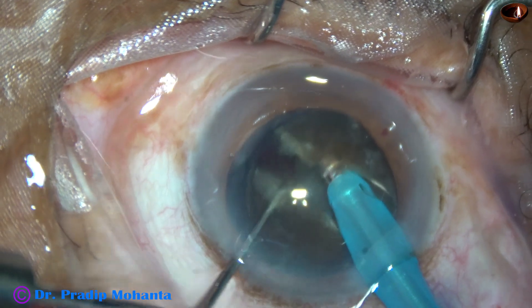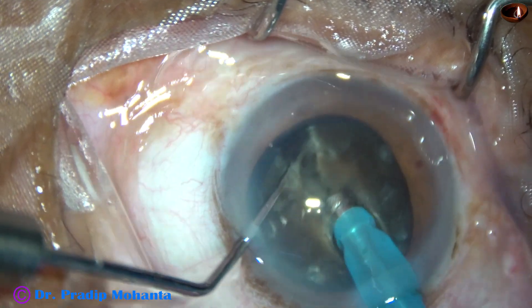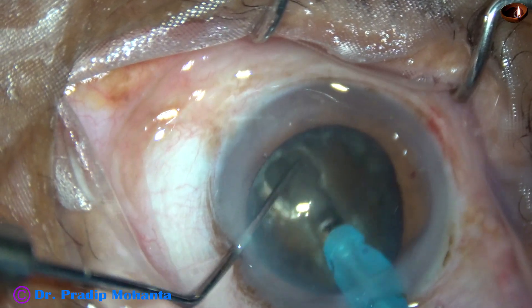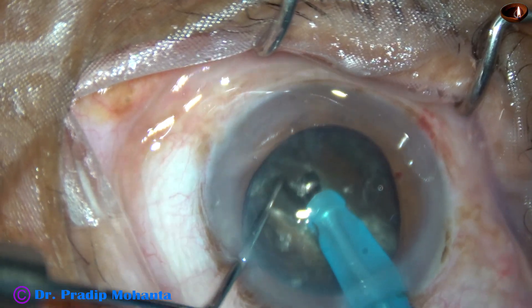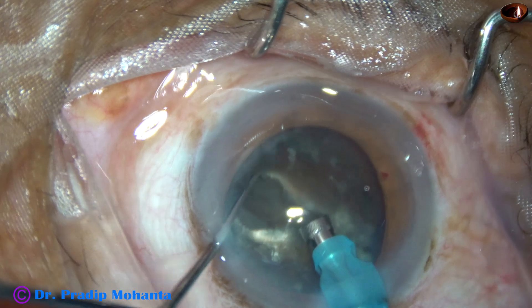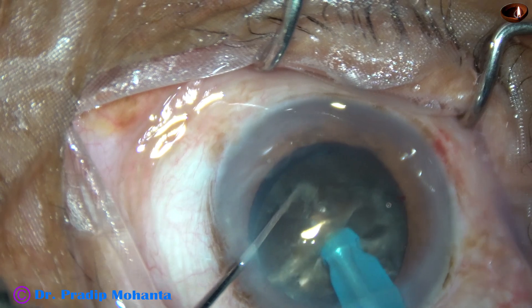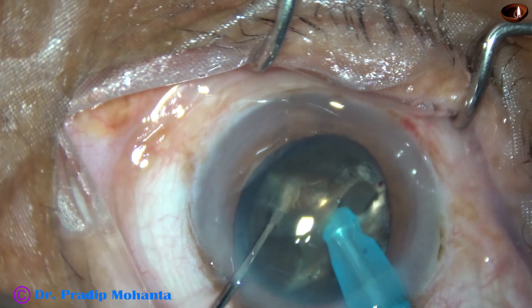Just go through the substance of the nucleus — just as a submarine goes through water. Reach near the opposite equator, and use your chopper to divide the nucleus. Now rotate it 180 degrees and separate the two hemi-nuclei completely.